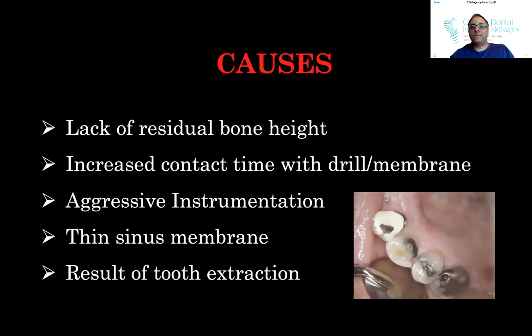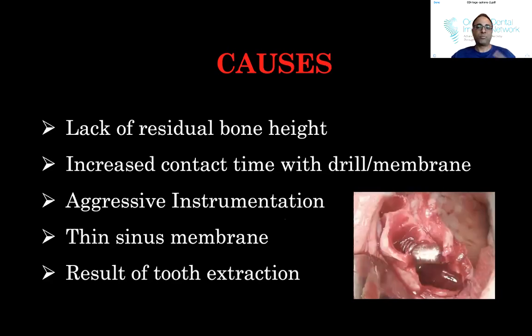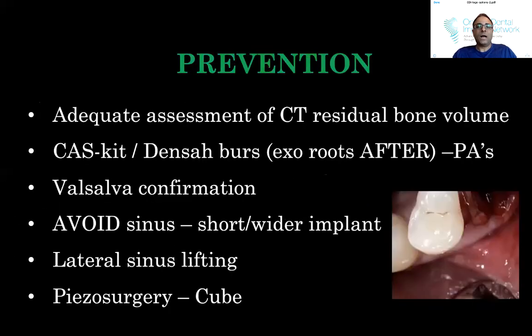Or you've extracted the teeth, and now there's a big perforation. And that's happened. You'll see this case on the lower right. This was an all-on case, and I could tell from the CT that the roots were in intimate contact with the sinus, and by the time I removed them, there was a monstrosity of a hole. Huge, to the point where I actually had to do a direct lift through the crest. And you guys have seen me do that a couple times. Once I had repaired the tear, I was then able to place an implant. Pretty much almost like a zygomatic implant, where just the apex of the implant was engaged in cortical bone. And we loaded this case as well. Okay, so sorry about that.